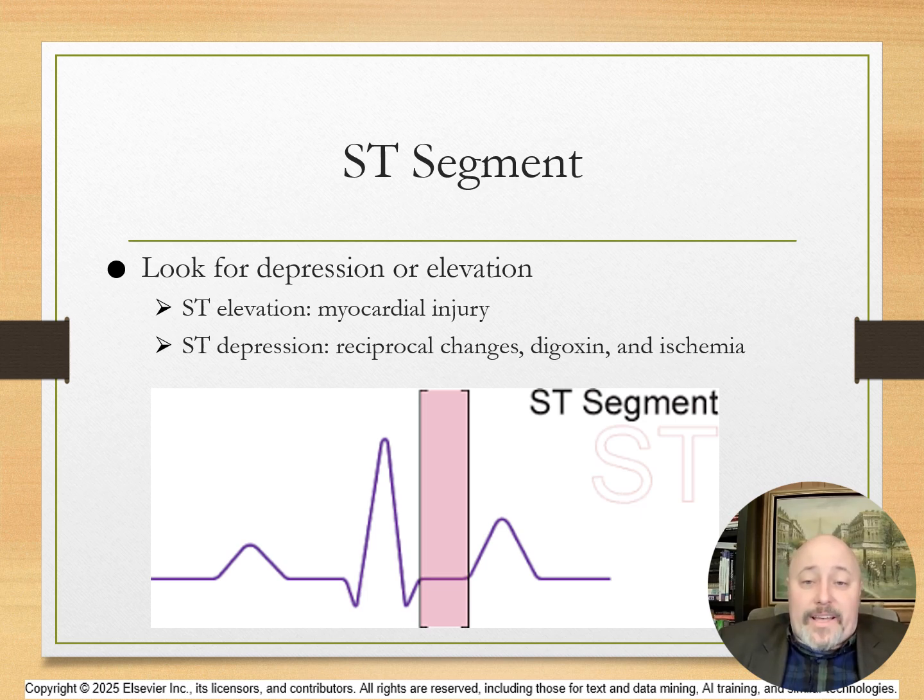To identify ST segment elevation, use the isoelectric portion of the PR segment as a reference for what is baseline. Next, note whether the ST segment is level with the PR segment, or is there a displacement in the ST segment that can indicate myocardial ischemia or injury.